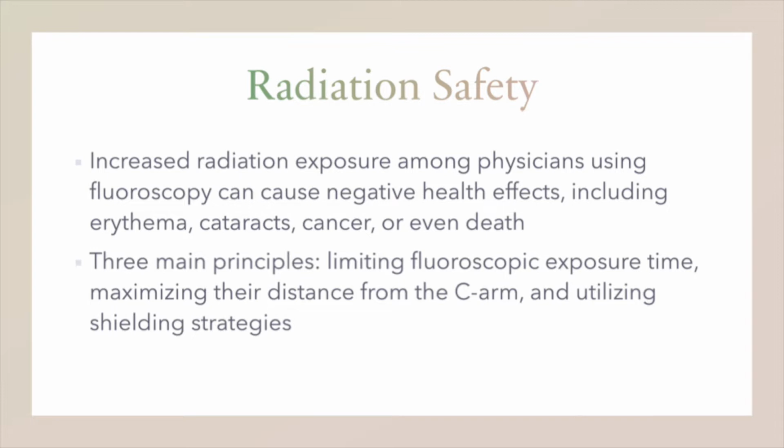To limit exposure time, attempt to use the C-arm in pulse mode as much as possible and limit the amount of live fluoroscopy. Next, to maximize distance, the participant should always take at least one step back from the C-arm prior to any images being taken. It is worth noting also the inverse square law when it comes to radiation exposure. That is, if you are 2 times further away, then your exposure is 1/4 what it was, and so on.